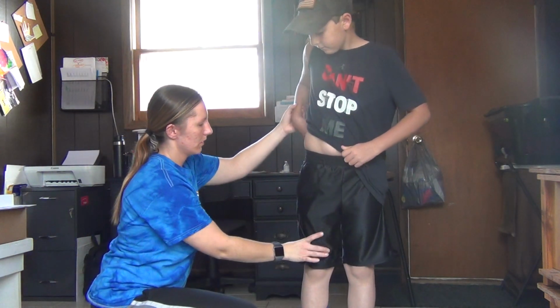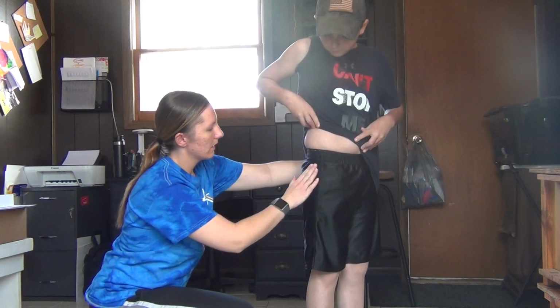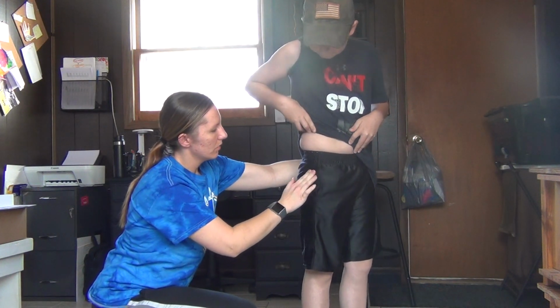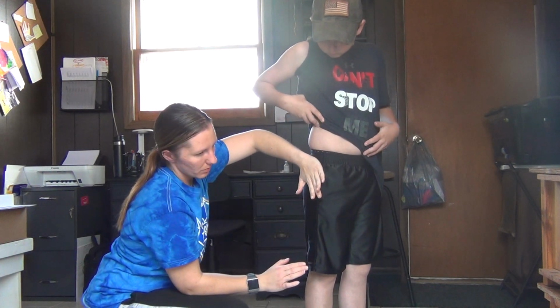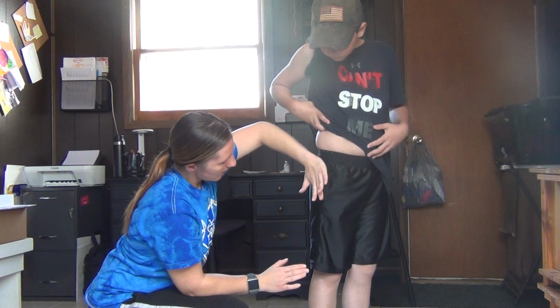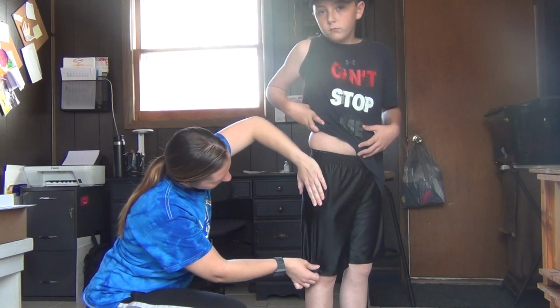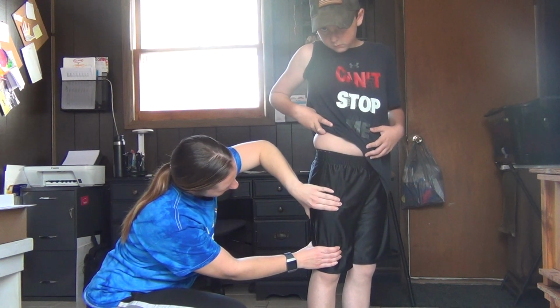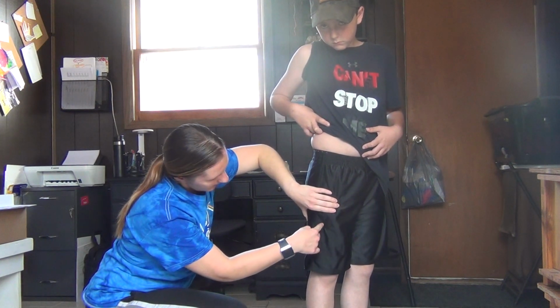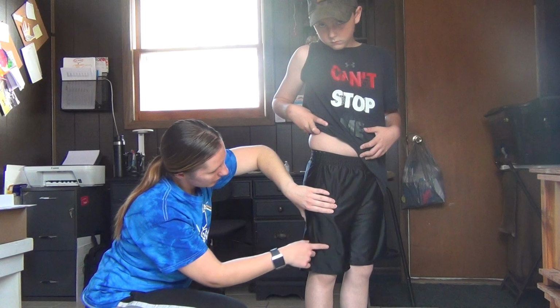And then if you could step up so we can better see. Hold your shirt, kind of go a little bit to the side. All right, so then I would find the greater trochanter and the lateral femoral condyle. And so then I would have this hand here, and I would inject right here in that imaginary triangle.